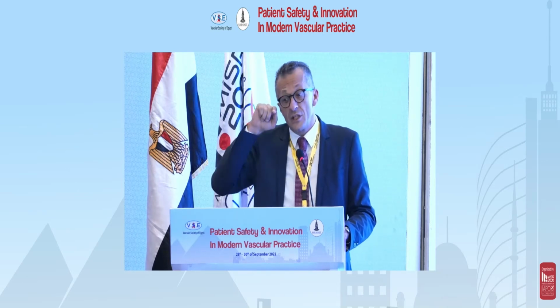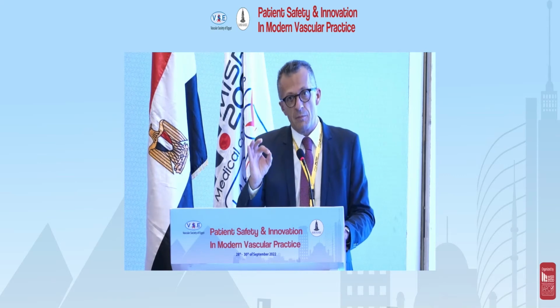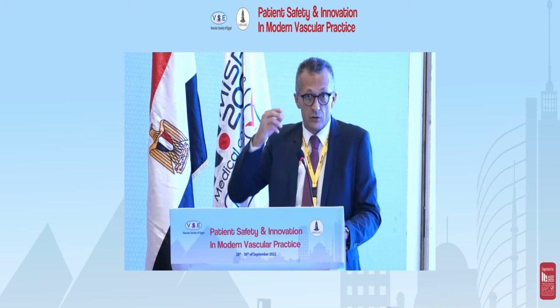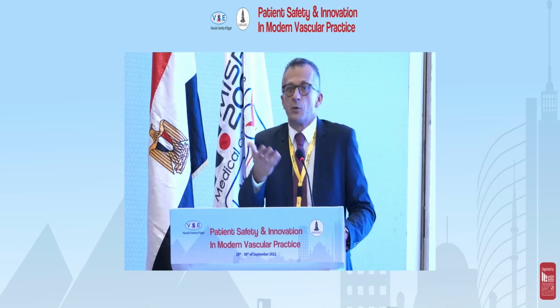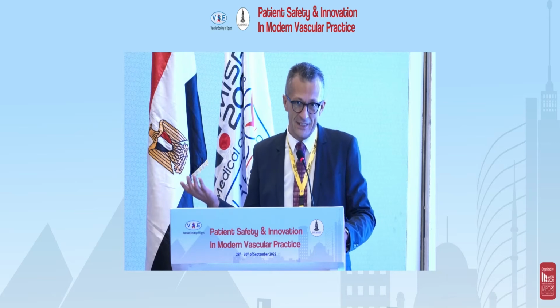I have just the guide wire that crossed the last part, to place a Bernstein catheter on the guide wire and to inject contrast medium to see in retrograde, because the contrast medium goes in retrograde, not in antegrade. It's also possible, but expensive, to use IVUS to evaluate this.